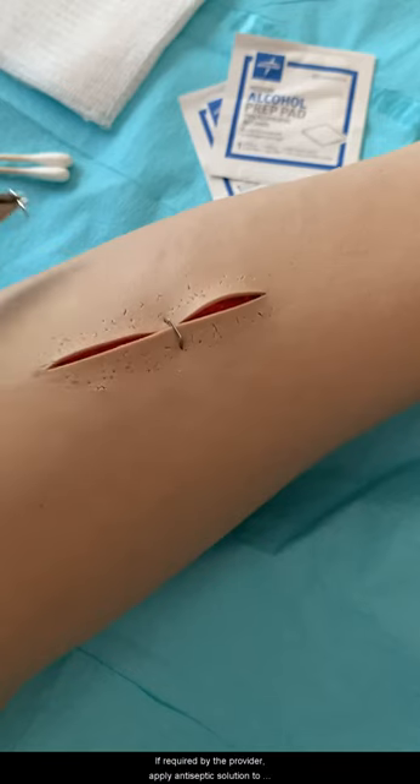If required by the provider, apply antiseptic solution to the site and allow it to air dry. Apply Steri-Strips if the provider requests, or a butterfly closure if necessary for support during the healing process, and bandage.